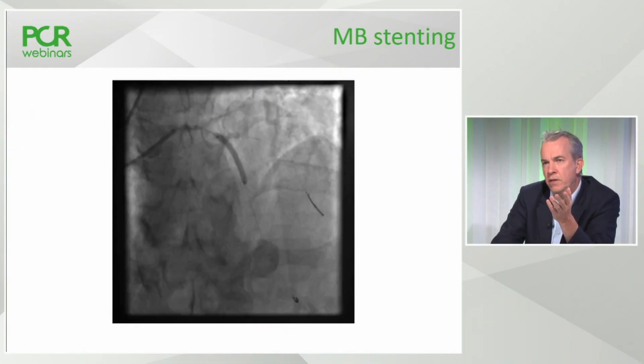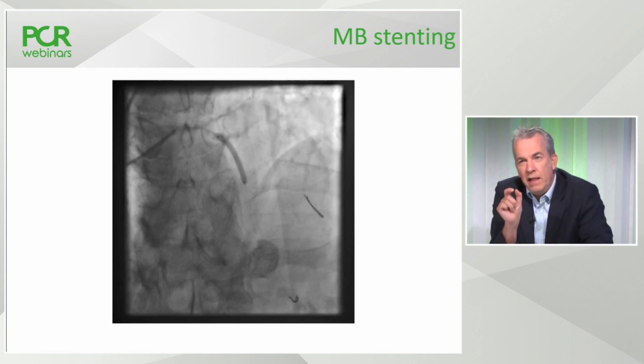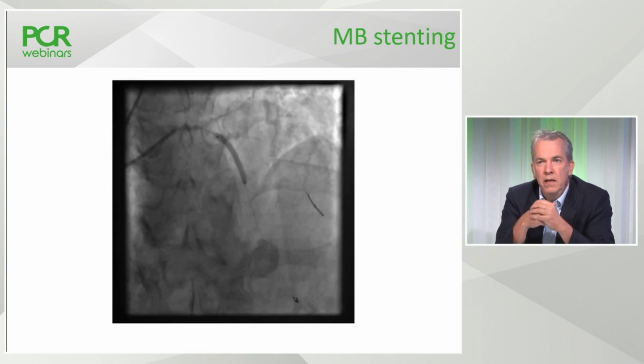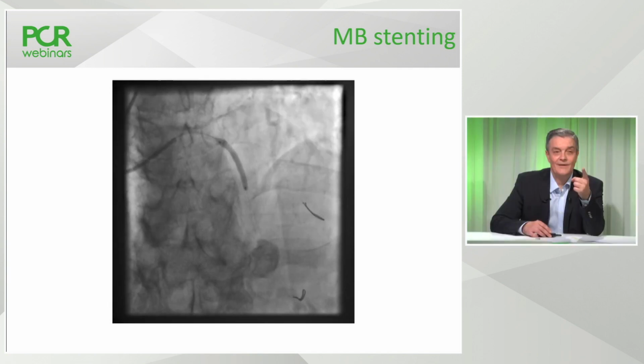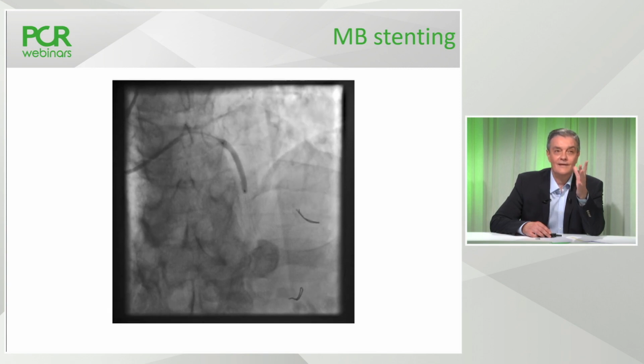Yeah, so now the stent in the LAD. I think in this case it was a 2.75 by 28, thereabouts. It looks like a 3 from here, but I'm very far away, with a little bit of overlap in the most proximal area. So that's sized according to the LAD, and we will now, and this is a step which people... Let me ask you, you left the jailed wire during the stenting, and there is also a question people would like to know more. Are you recommending jailing the wire during deployment of the second stent or not?